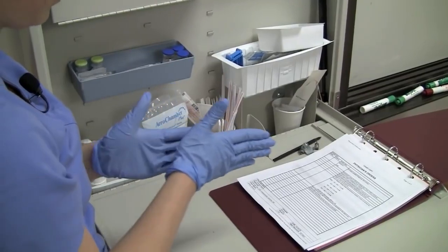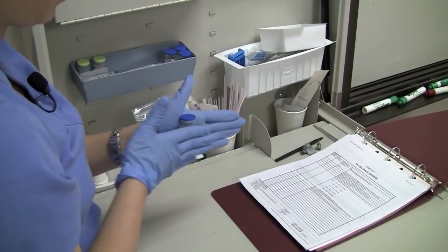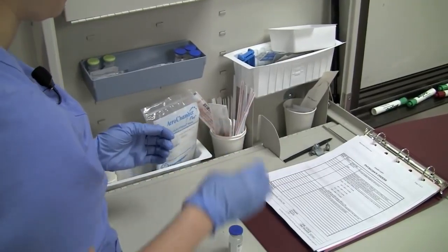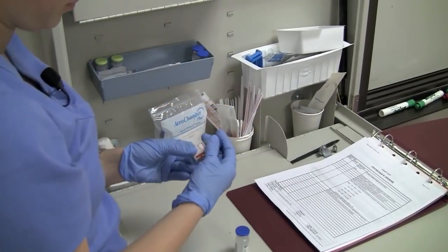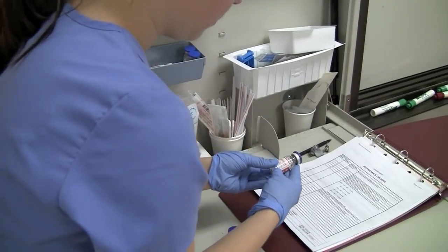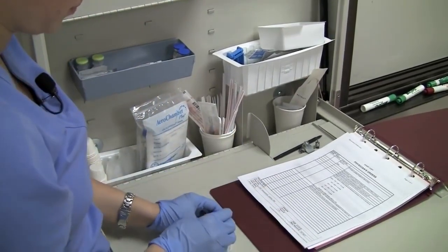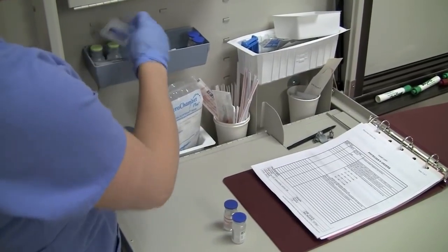Mix the solution by rolling the vial gently between your hands. When mixing insulin, always withdraw the regular insulin, which is clear, first to minimize the possibility of the regular insulin becoming contaminated with the additional protein in NPH, which is cloudy. Remember: clear before cloudy.